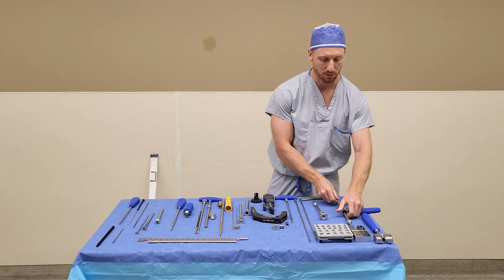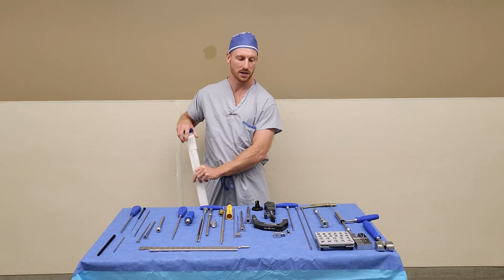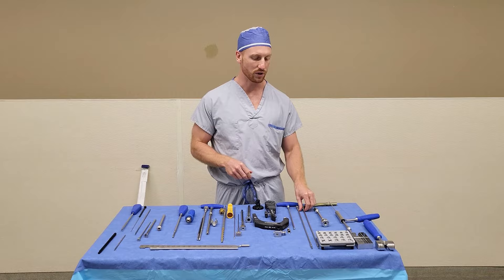After that point, the assembly will come out. If you are doing a long TFNA nail, you will move to the reaming portion. You'll need to open your Synthes ball tip guide wire and hand that up to the surgeon. He or she will insert that into the femoral canal, at which point you can start to load your reamers.